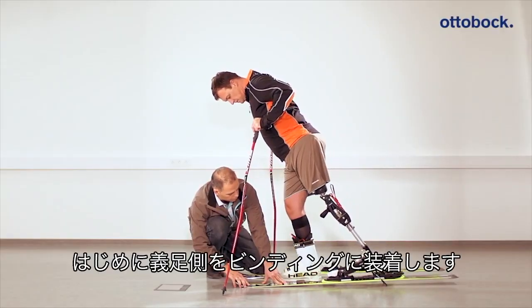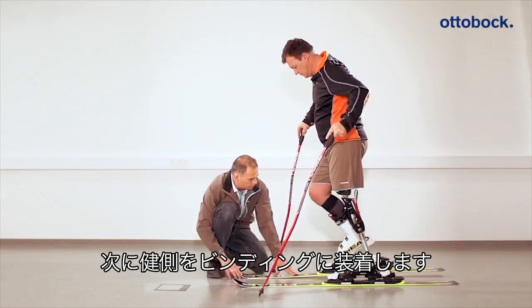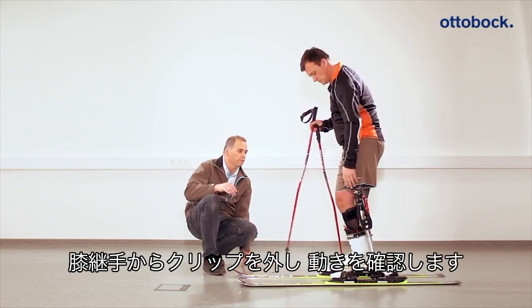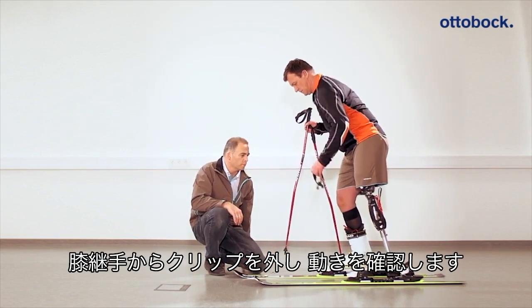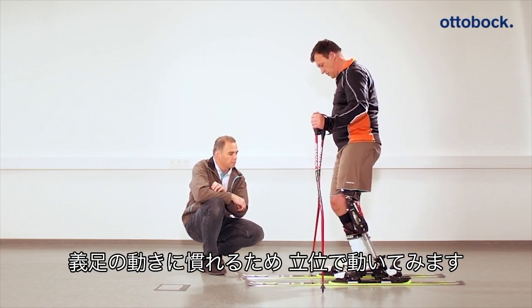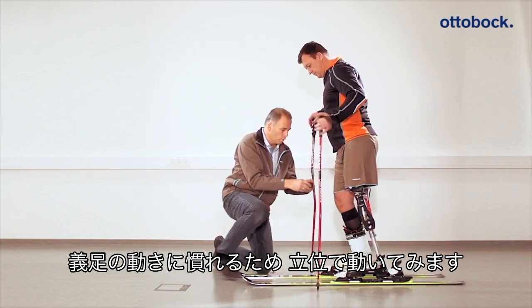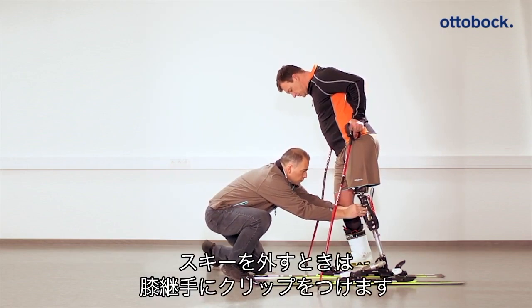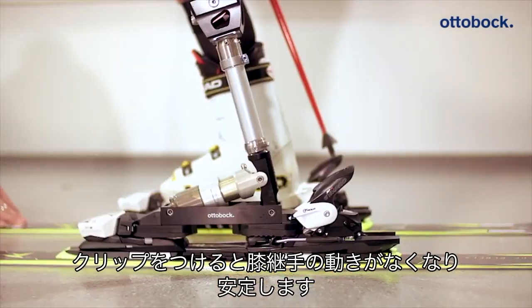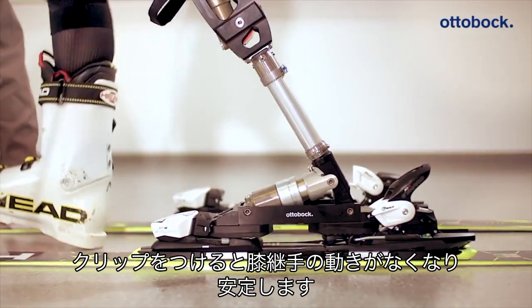So the user has steady footing, he or she should step into the ski binding with the prosthesis first and only afterwards with the intact leg. In order to get a feel for how the hydropneumatic system behaves, the blocking clip is removed. As soon as the user has steady footing, he or she should become familiar with the system and perform initial exercises while standing. For the patient to be able to step back out of the ski binding, the blocking clip must be reinserted first to allow the patient to walk without spring movement of the knee joint and get a steady footing.